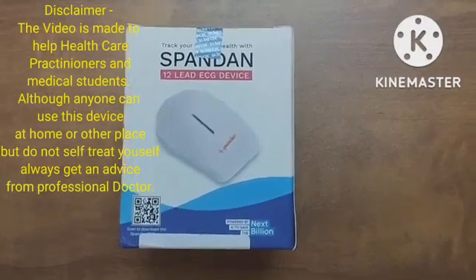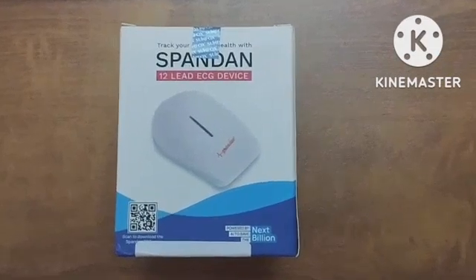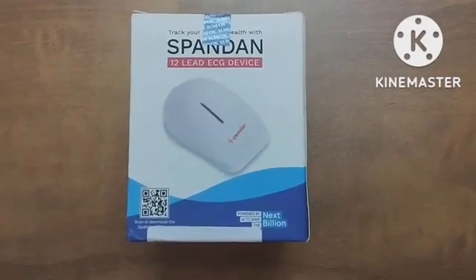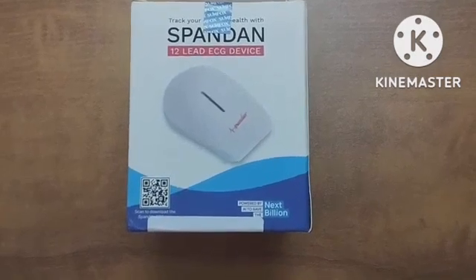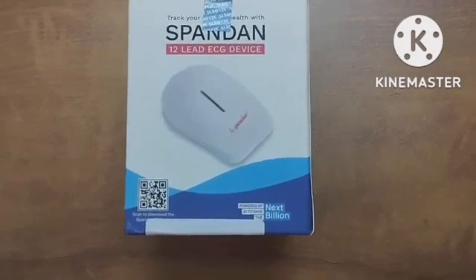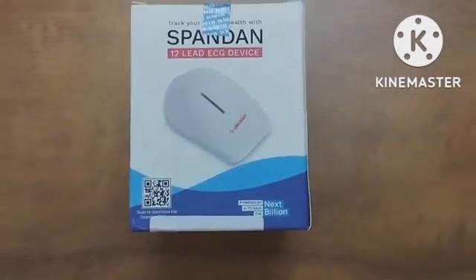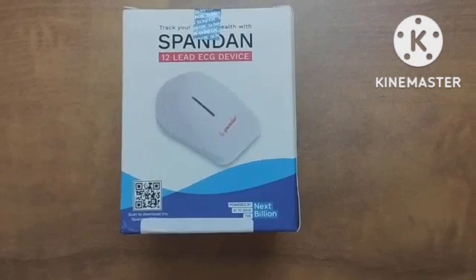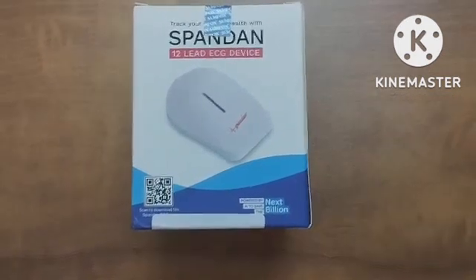Hello everyone, welcome to this video of unboxing Spandan 4.0 portable ECG machine. Many of you must have seen this machine or device on Shark Tank India. I like the concept and device because of a few reasons which I will reveal after a short time. But first, let's unbox the ECG machine.